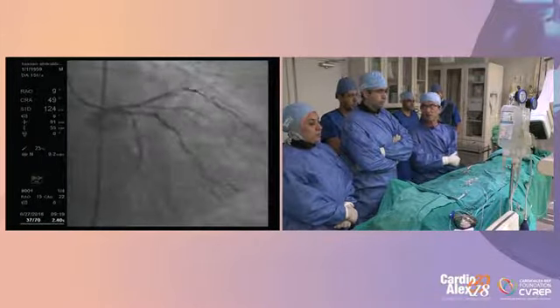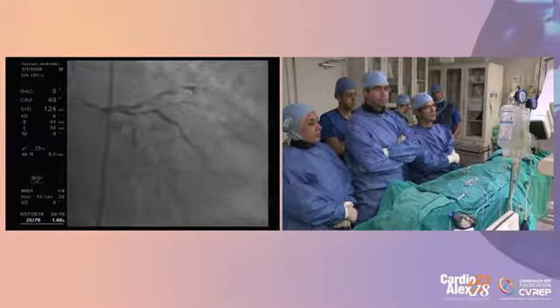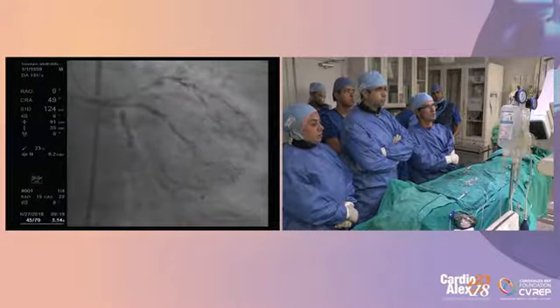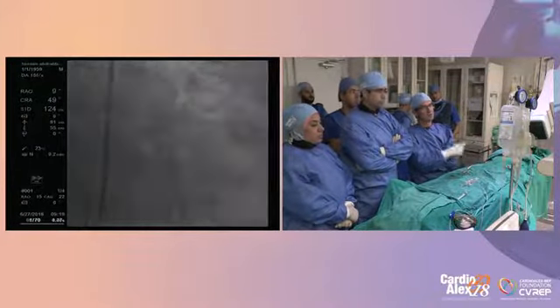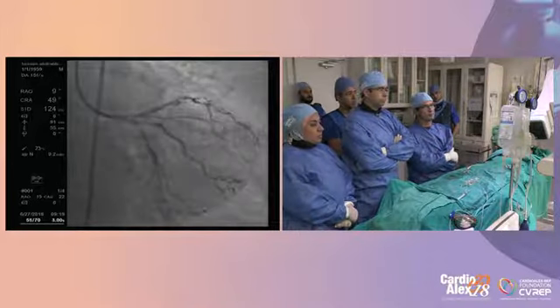The answer may be that he was partially improved by circumflex stenting in January. So now he is back to the previous clinical status. And we will show you the angiogram, which is interesting, and we also performed an IVUS.